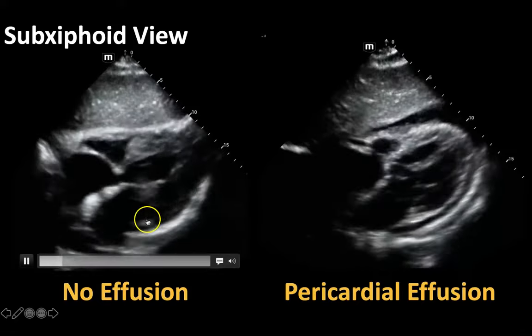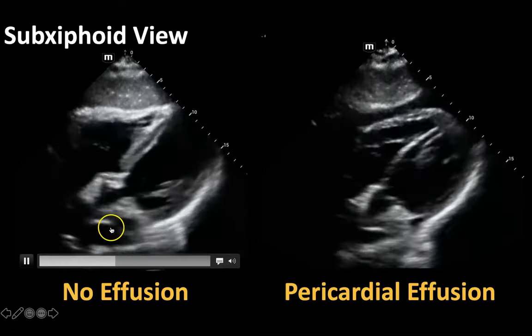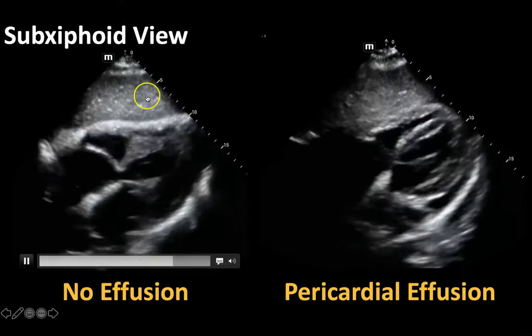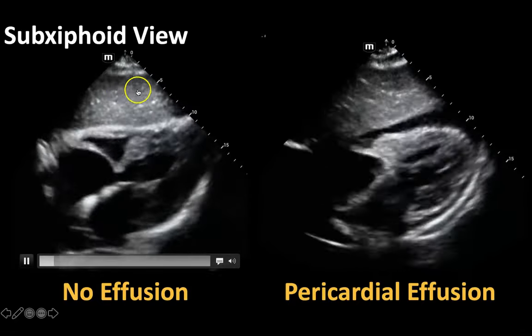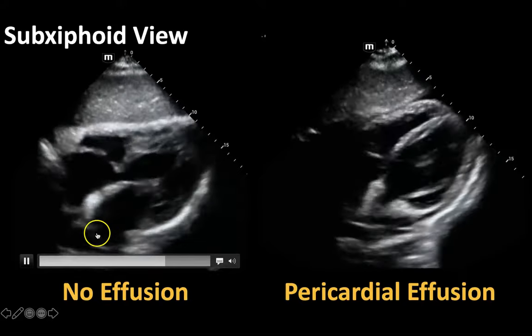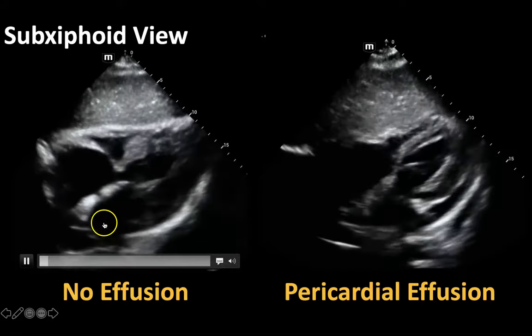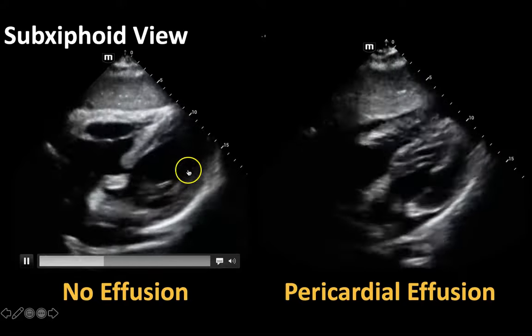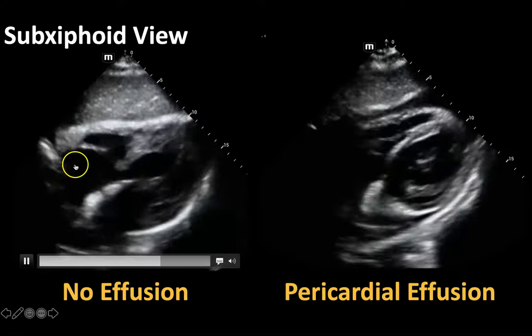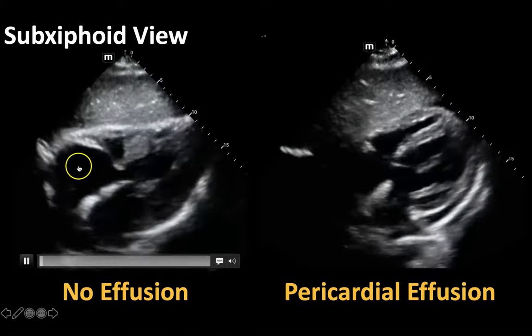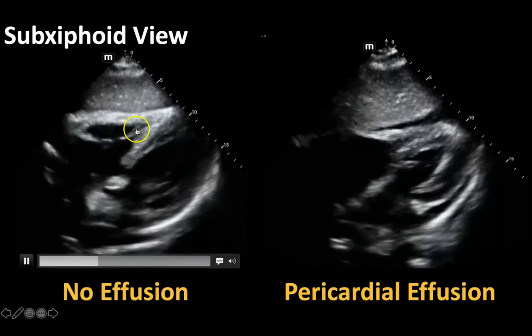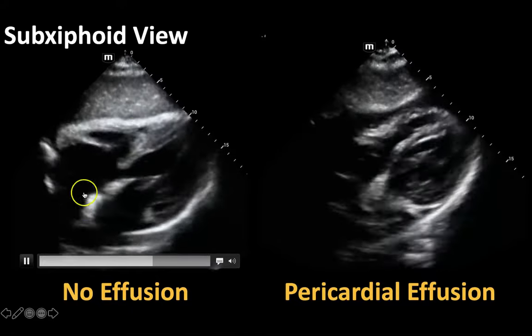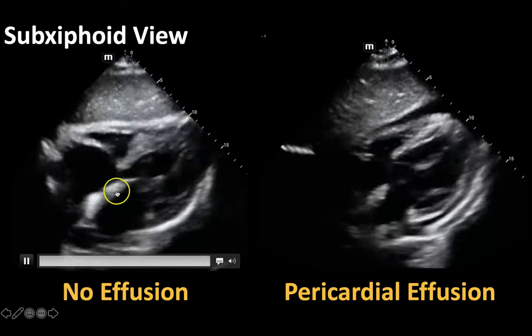To remind you of some anatomy — here's your liver up here most superficially, and then back here you have your left atrium, your left ventricle, your right atrium, and your right ventricle kind of coming in and out of plane.